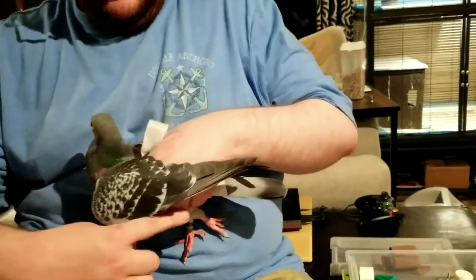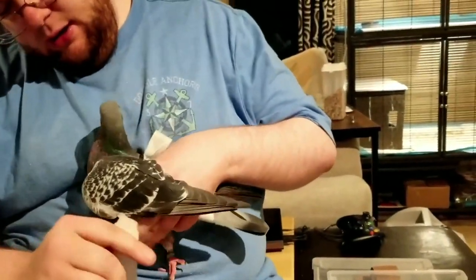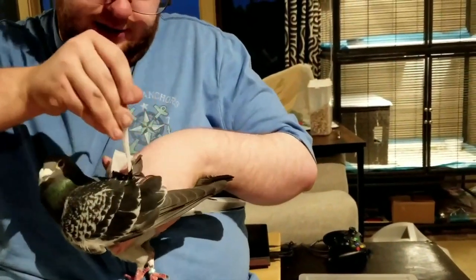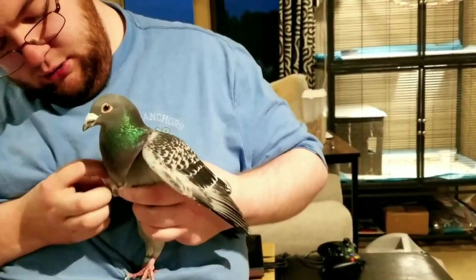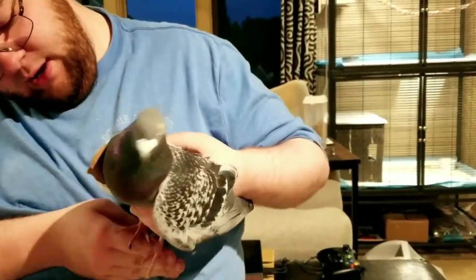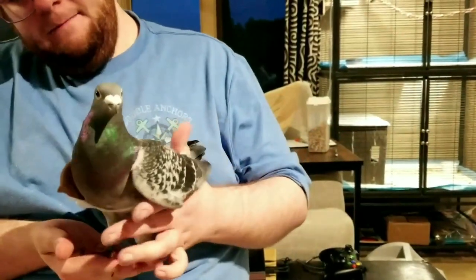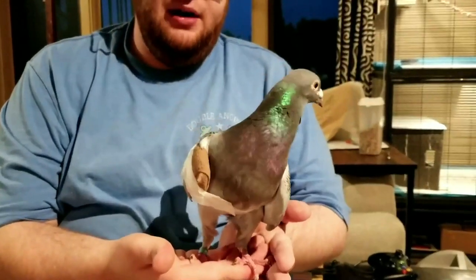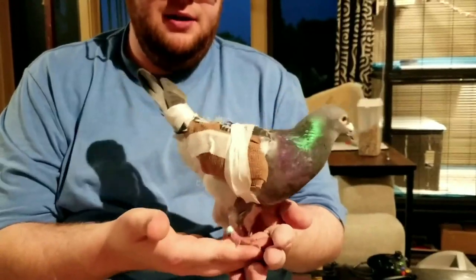I've got it mounted on the front of his wing here. Take it and go below. You don't want this super tight because that will compress air sacs, and that is what we call not good. I also like to make sure it's all stuck together well. So it's not pretty — you can do it prettier if you want — but that will work perfectly fine.